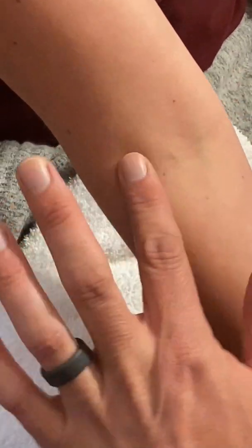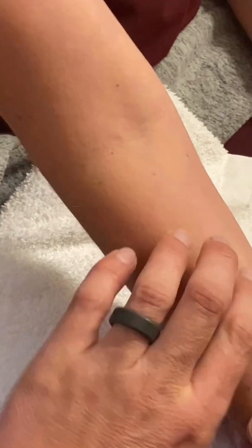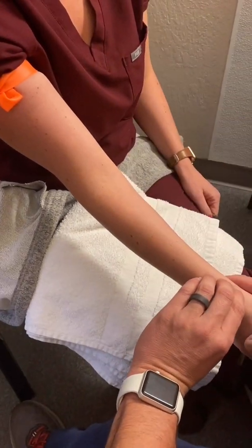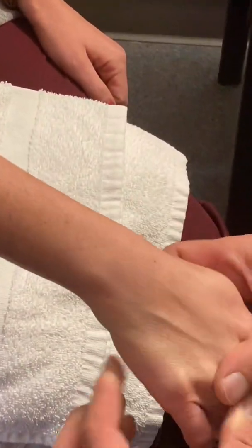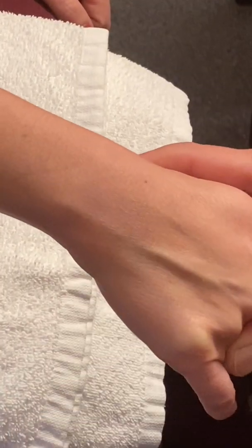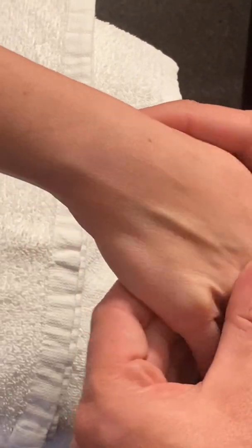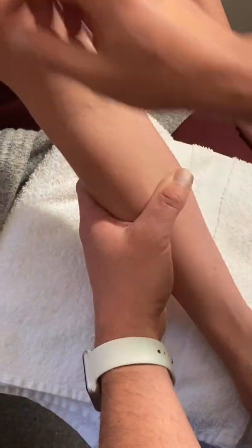And Crystal here has amazing veins. I have lots. Yeah, she has really good ones all over. You can see the hand ones here as well. And sometimes it's okay to give a light slap on the veins, and it helps increase the volume on that vein to bring it more to the surface. And you can see how it just brings it up. Nice. Very nice and plush. So for this purpose though, we will go right here. All right.